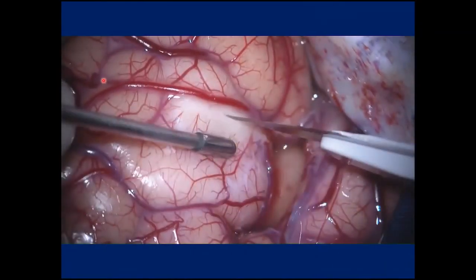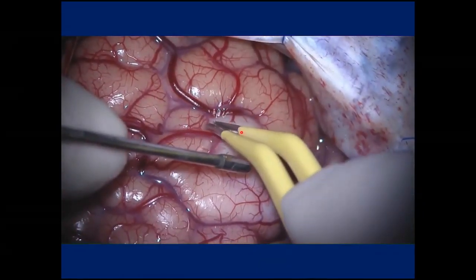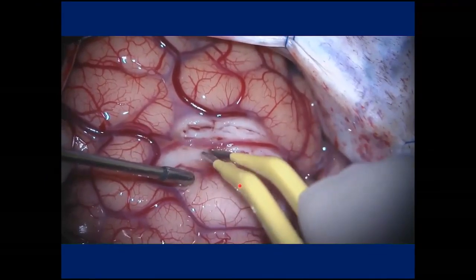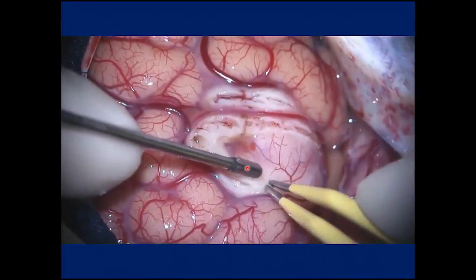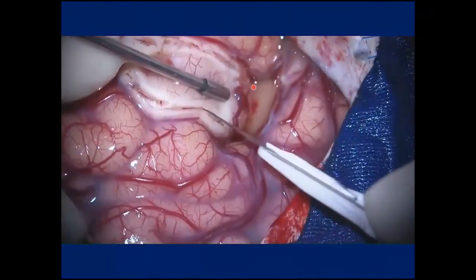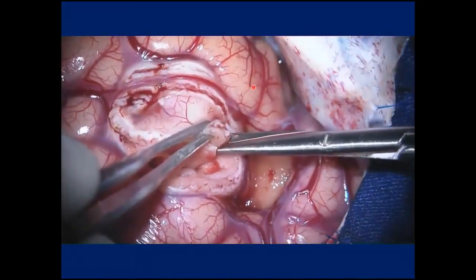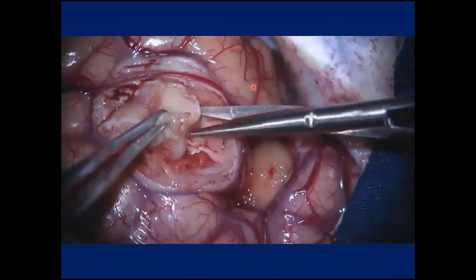I want to remove this part of the cortical dysplasia, but I don't want to sacrifice this cortical branch of the MCA because it will supply the areas over here of the brain. So I have to work on each side of the cortical branch of the MCA. Now I'm establishing where I want to debulk because I want to get a lot of samples for histology analysis. Type 2 cortical dysplasia is usually very hard, so you have to use stronger scissors to cut this cortical dysplasia.